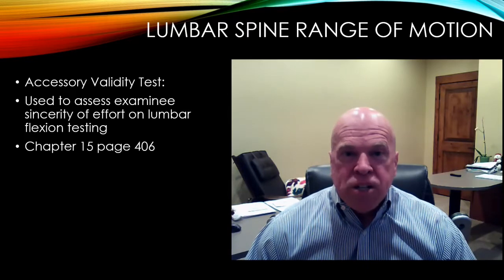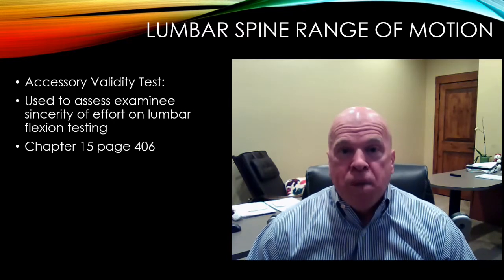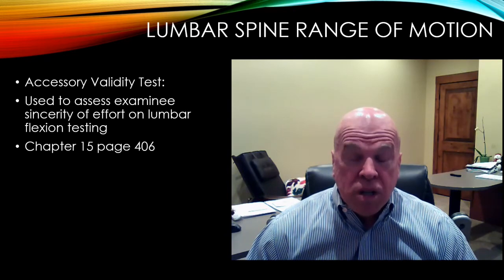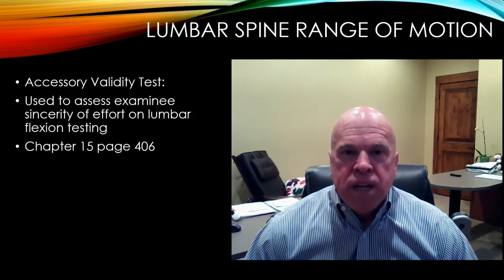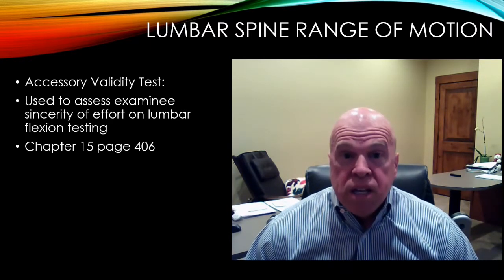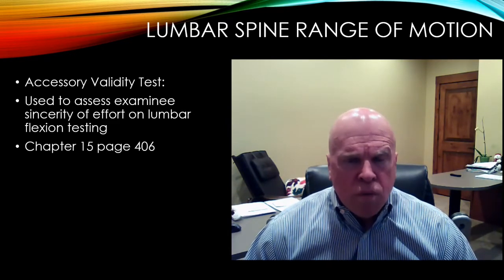Now, let's just imagine that you're a qualified medical evaluator that does not use inclinometers, that simply eyeballs range of motion measurements, and you provide a permanent impairment rating for your examinee according to the DRE method. Now, imagine that you're in a deposition and one of the attorneys says to you, "Doctor, I noticed that you provided an impairment rating using the DRE method. Is that correct?" Correct. "And is there a reason why you did not use the range of motion method?"